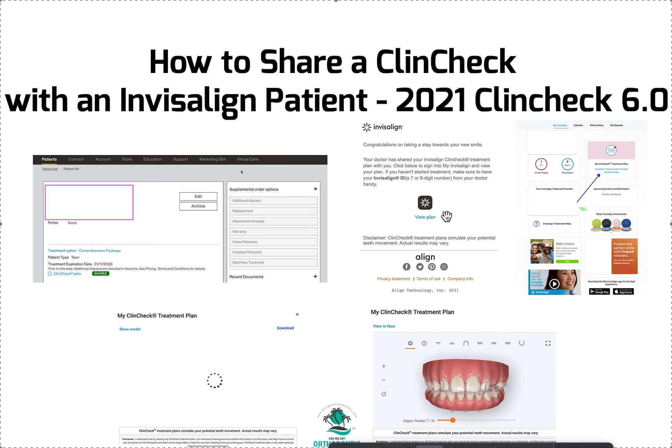Once you click on that it's going to have you verify, and it will take you to the ClinCheck view. Also, doctors — before you even send this — on the first screen it's going to give you options: ClinCheck with attachments or without attachments, with precision cuts or without, with IPR or without IPR. So if you want to keep it simple you can, or you can include everything if the patient is asking for it.